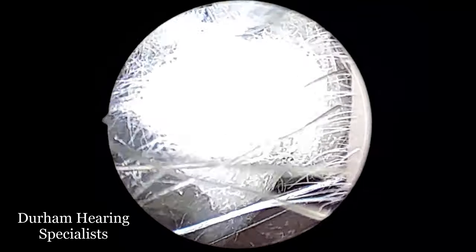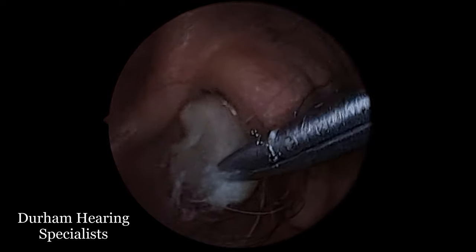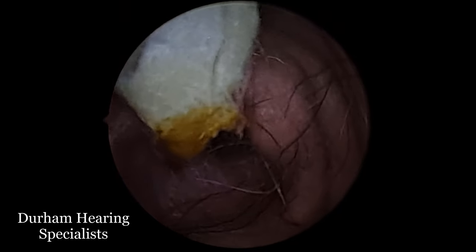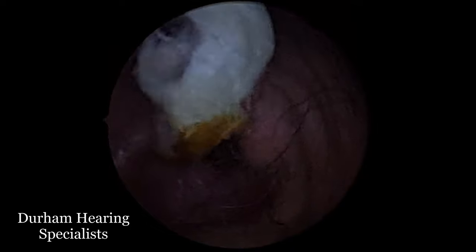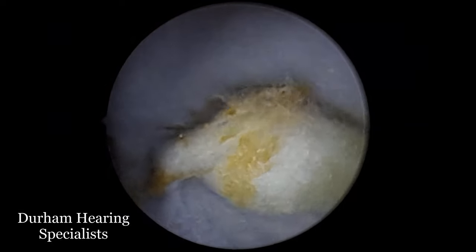So what some people do is when they have an earwax blockage and they're applying drops, whether it's olive oil or sodium bicarb, they'll put a little piece of cotton wool just at the entrance of the ear to keep that solution in there, in the hopes that it'll penetrate further and not drip back out and create a mess — which is not the worst idea in the world.